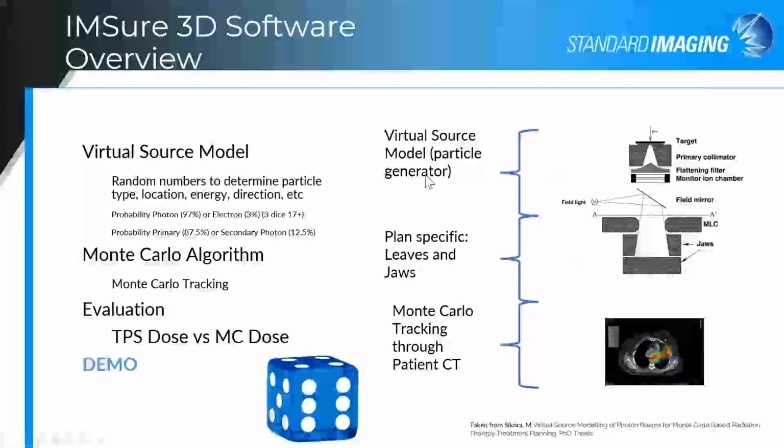And finally, I'm going to try to tie up the workflow that is occurring inside of the IMSure 3D calculation system. So there's a virtual source model, which you can think of as the particle generator, from that beam modeling that I've been talking about.